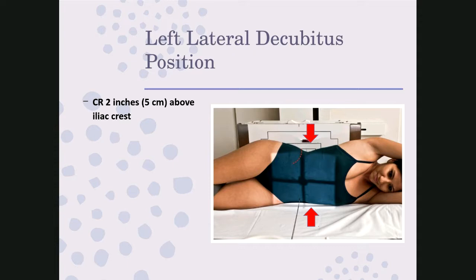When we talked about chest decubes, we said that we always do both. With abdomen, we don't necessarily do both. We most likely are to do a left lateral decubitus abdomen if they order a decubitus view on the patient. When we look on page 121, some of the clinical indications would be an abdominal mass, when you're looking for air fluid levels, and possible accumulations of intraperitoneal air can be demonstrated. Okay, you can also demonstrate small amounts of free intraperitoneal air.